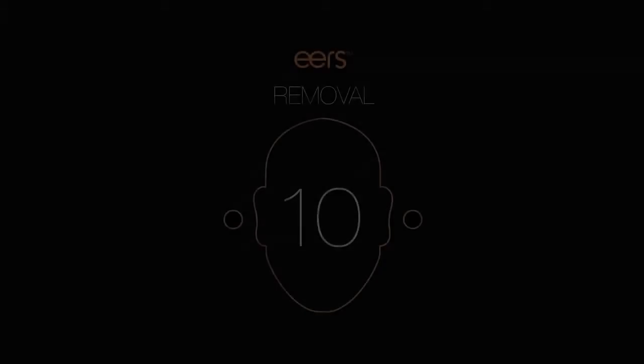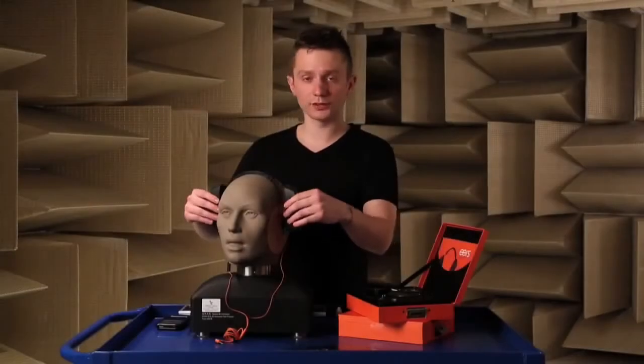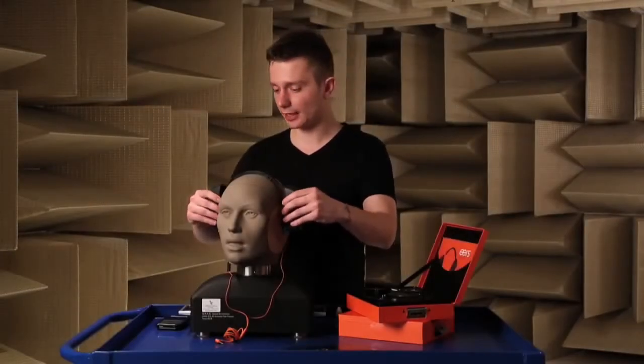Good, the time is up. Now remove the fitting system by grabbing it and pulling outward.